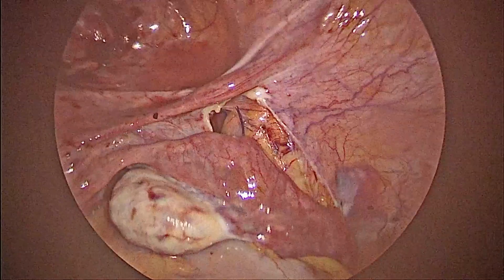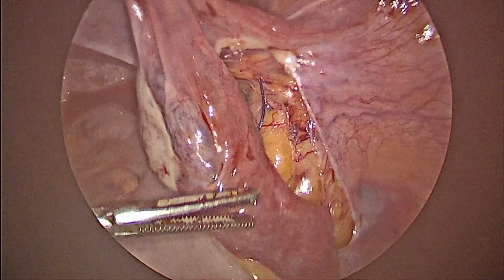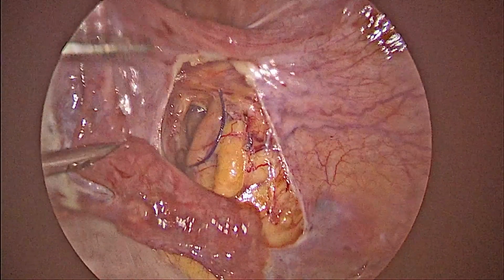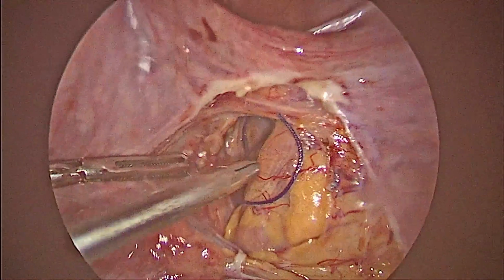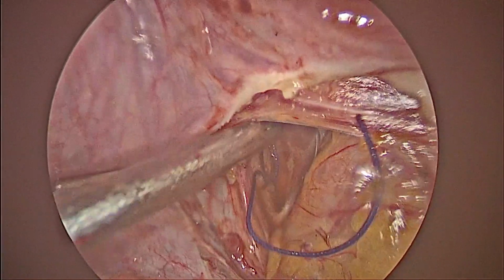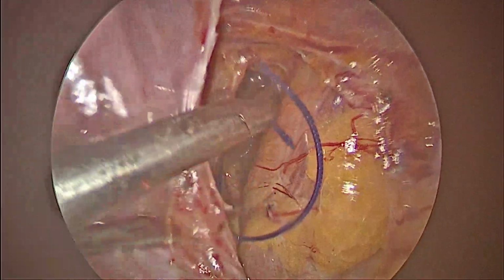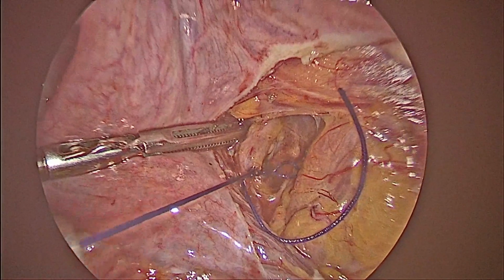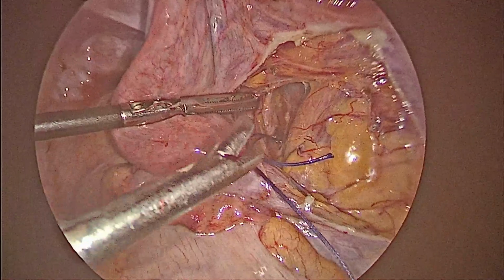So now we are trying to remove the shoelace pattern ligation of the uterine artery. So the temporary ligation of the uterine artery, which was ceasing the blood flow to the uterus, should be pulled slowly with counter traction, under vision, so that we do not injure the vessels while doing this.